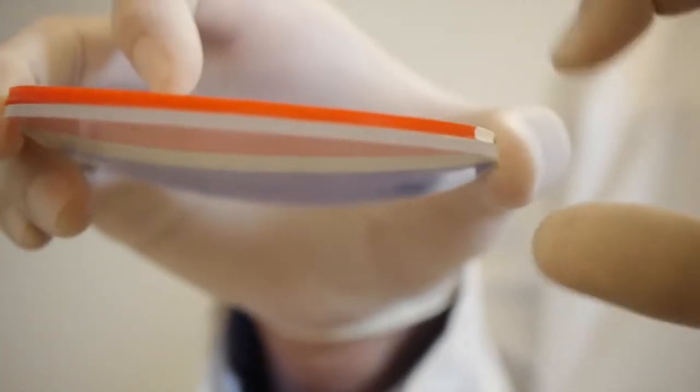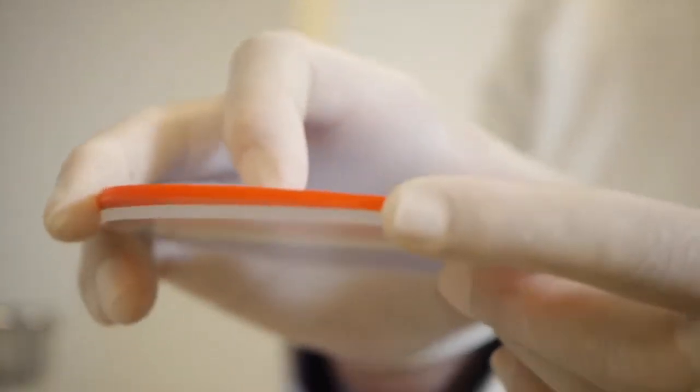There is approximately 40% shrinkage during fabrication. So this will give you about a 3.5 to 4mm thick mouthguard, exactly what the literature says you need as a minimal thickness for a professional mouthguard.